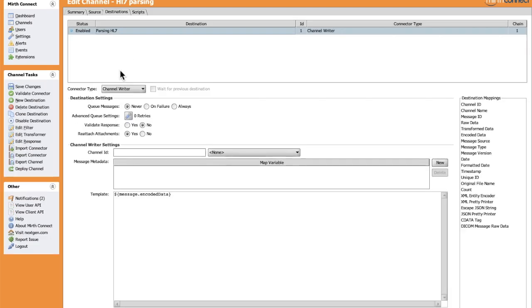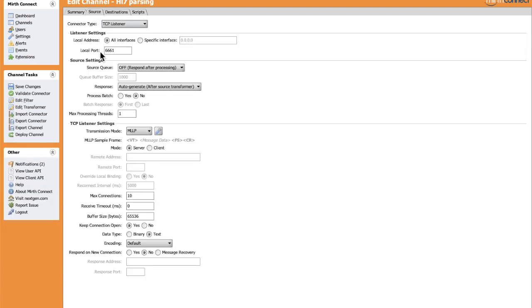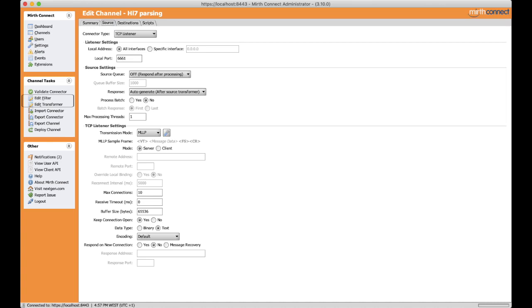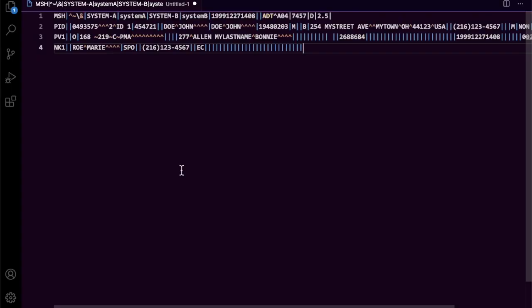As you see in the left menu, we have two buttons: Edit Filter and Edit Transformer. In case we want to filter HL7 messages with specific criteria on a specific field, we can use the Edit Filter button. On the other hand, we use Edit Transformer to parse an HL7 message and convert it from the HL7 structure to a set of field values, as we will see in a minute. We will need an HL7 template message.